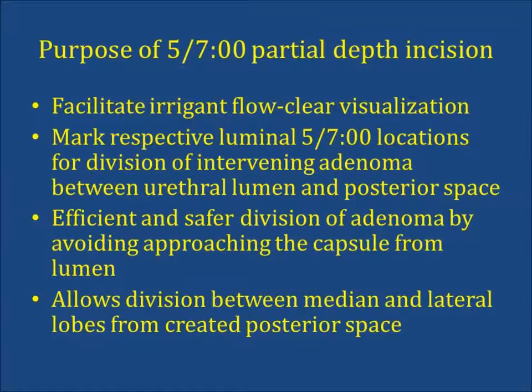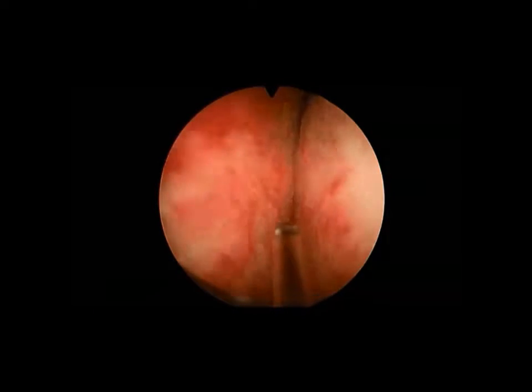Secondly, we would like to mark the respective luminal locations at 5 and 7 o'clock for division of that intervening adenoma in the latter part of the case once the posterior space has been established. These incisions are more efficient because we make no attempt to reach the capsule and therefore avoid any risk of perforation at the beginning of the case.